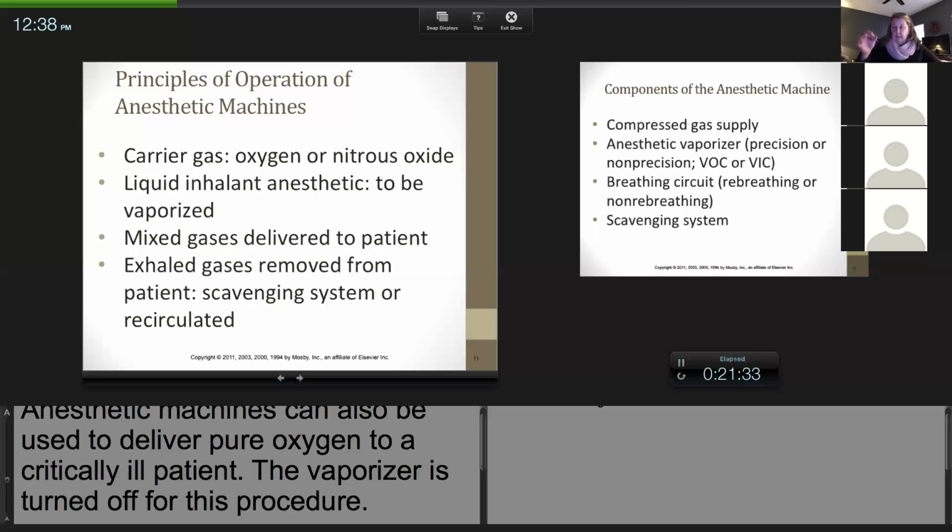If you're at the dental station, you guys are using that carbon filter, that F-air, or is that charcoal? Yeah, that F-air canister. And so when the animal exhales, that's considered a passive system because it's not actively pulling. When the animal exhales, it'll absorb the exhaled anesthetic, and you weigh it and dispose of it periodically.